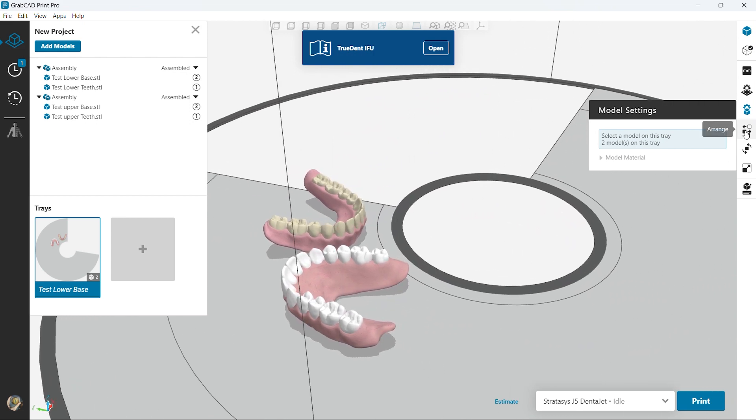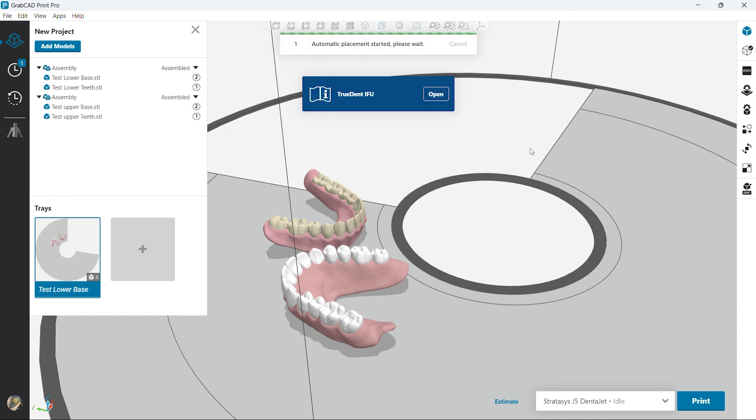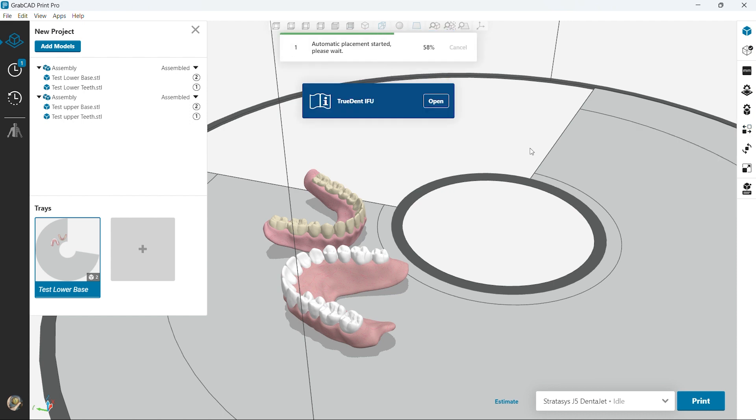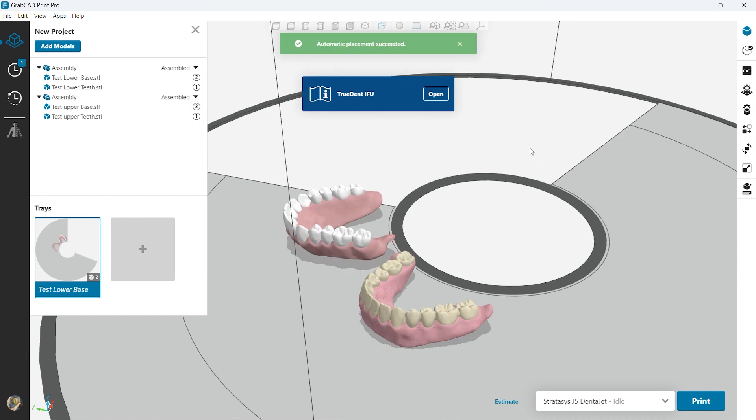So now we have them colored and we want to actually print them. What do we do? Let's go ahead and have the software automatically arrange them. And once we get them arranged we are ready to print. It's honestly that simple.